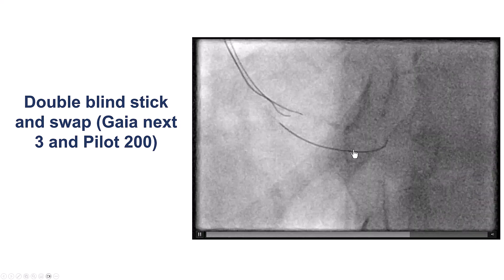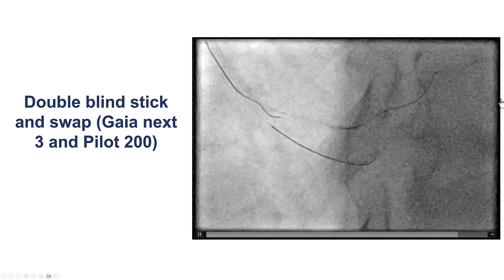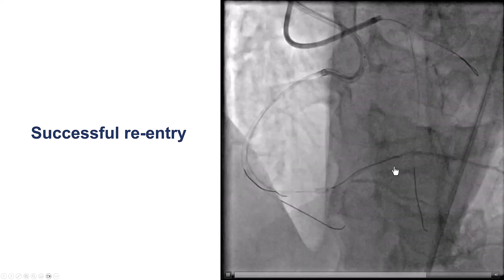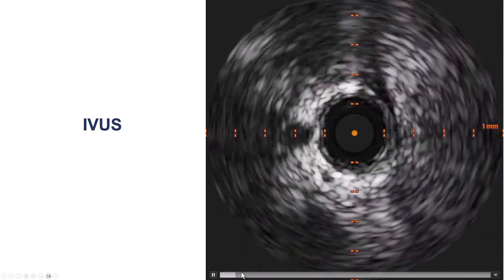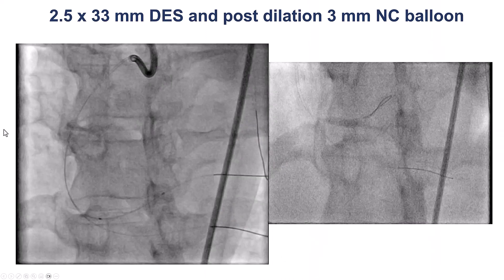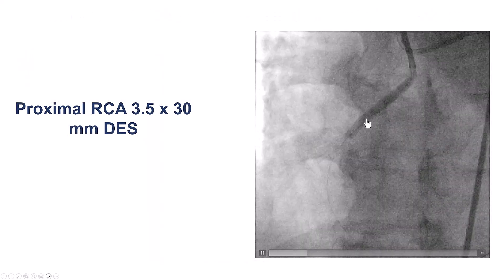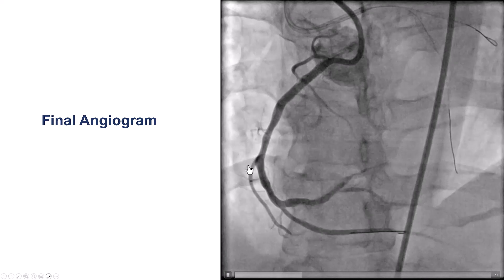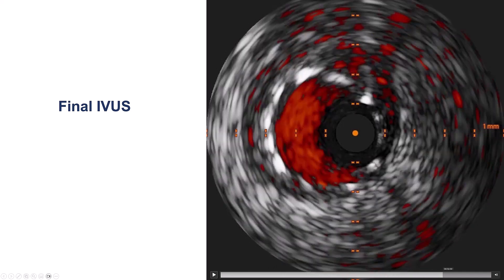In cases like this where the vessel is relatively small, the double-blind stick and swap can be useful — creating a puncture and then advancing a polymer wire along the course of the vessel. We confirmed with contralateral injection that we were inside the distal true lumen in a small branch, redirected the wire during injection, then performed balloon angioplasty. Intravascular ultrasound showed some calcification but the vessel was acceptable. We placed a 2.5 by 33 mm drug-eluting stent, post-dilated it, and placed an additional stent more proximally in the RCA, achieving a nice final result with TIMI flow into the right posterior lateral. IVUS showed good stent expansion and apposition in the posterior lateral and proximal right coronary.